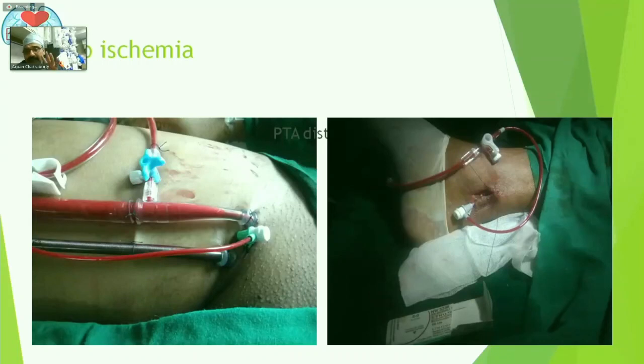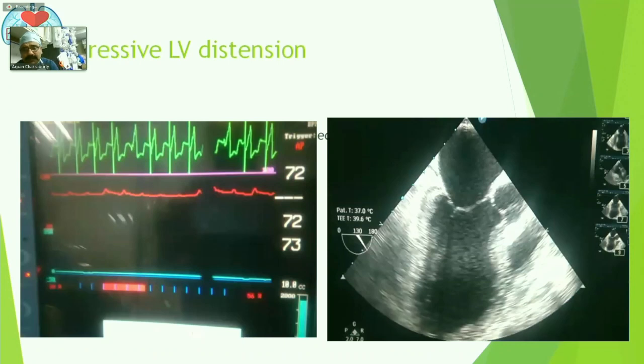So you can only think that at the time when perfusion to the patient is utmost important, you should cannulate the patient first for the venous and the artery, and then run the ECMO. Then go for the femoral distal perfusion cannula.